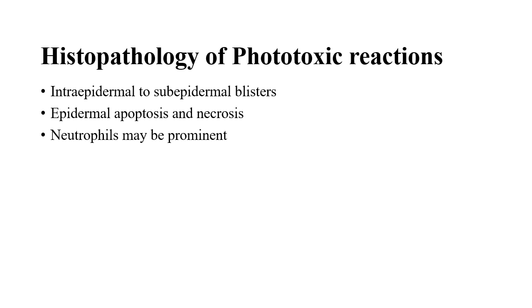Histopathology of phototoxic reaction. In them, there is formation of intraepidermal to subepidermal blisters, epidermal apoptosis and necrosis, and neutrophils may be prominent.